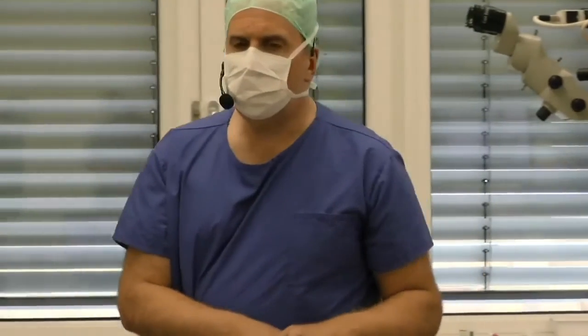There was one question, thank you for that, about if I would do an implantation of a multifocal add-on IOL in a patient who already underwent a YAG laser capsulotomy. I would answer this question with an absolute yes.